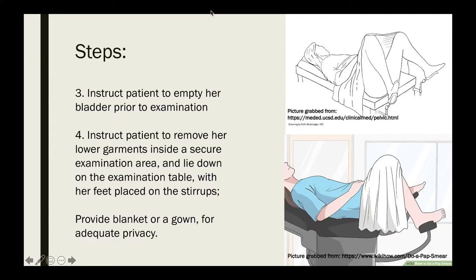Instruct your patient to empty their bladder prior to examination, as a full bladder can make the exam very uncomfortable. Instruct the patient to remove her lower garments inside a secure examination area and lie down on the examination table with her feet placed on the stirrups or footrest. Make sure that you provide a blanket or a gown for adequate privacy.